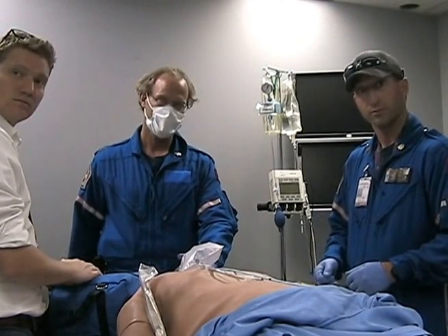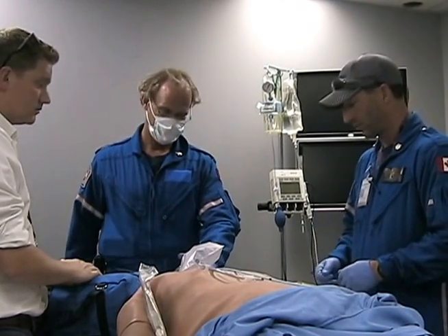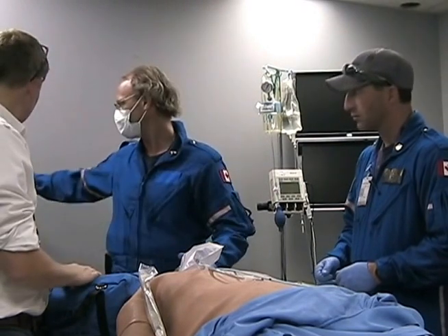Okay. Equipment, PPE, gloves, mask, goggles. I have one. BVM plus minus PEEP valve. It's right here.